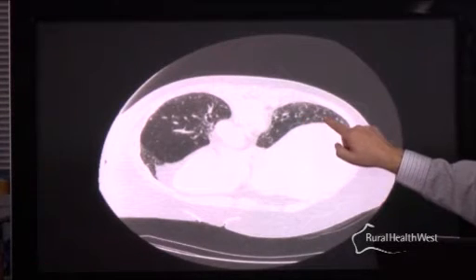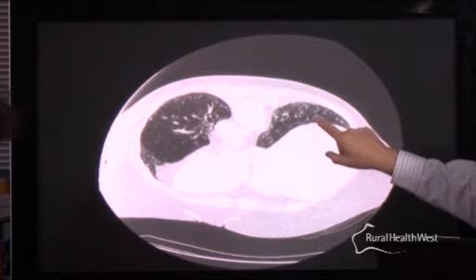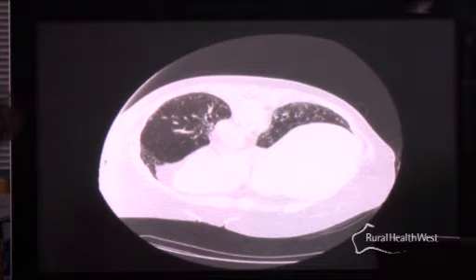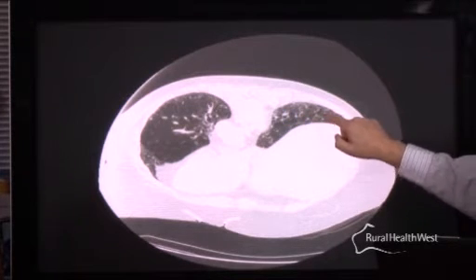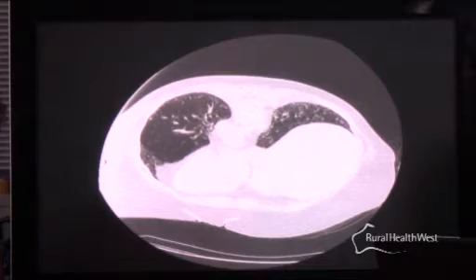What's UIP for those who don't use it? Usual interstitial pneumonitis, or what was previously termed cryptogenic fibrosing alveolitis. Okay. So one of the associated changes with chronic interstitial fibrosis is that when you're looking at the bronchi in the lower lobes, if you find a bronchus and an accompanying vessel, they should be about the same size. But in this case, you can see the bronchi are much larger than any of the accompanying vessels. So the patient has got bronchiectasis.